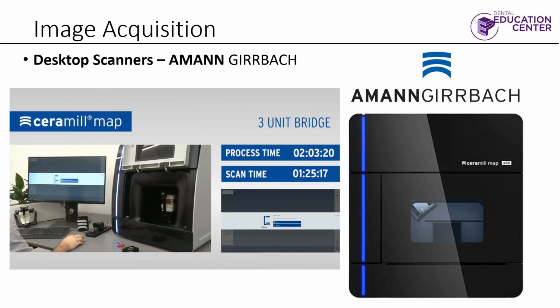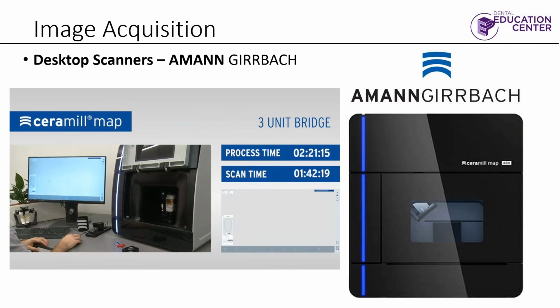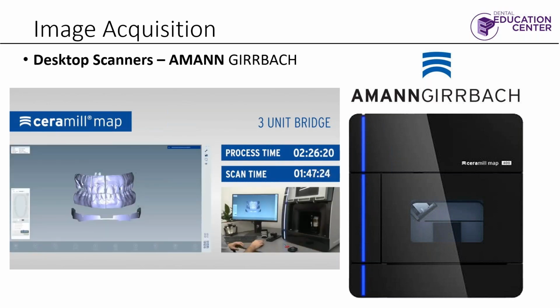Yeah, no, absolutely. And obviously, this stuff is very important. Garbage in, garbage out. I don't care if you're starting with a model or with a digital scan. You have to be very careful of how you start. No matter what your level of technical ability is, if you're layering ceramic or how great your mill is, if you start with a poor scan, everything else just kind of falls off downhill. You have no control after that.